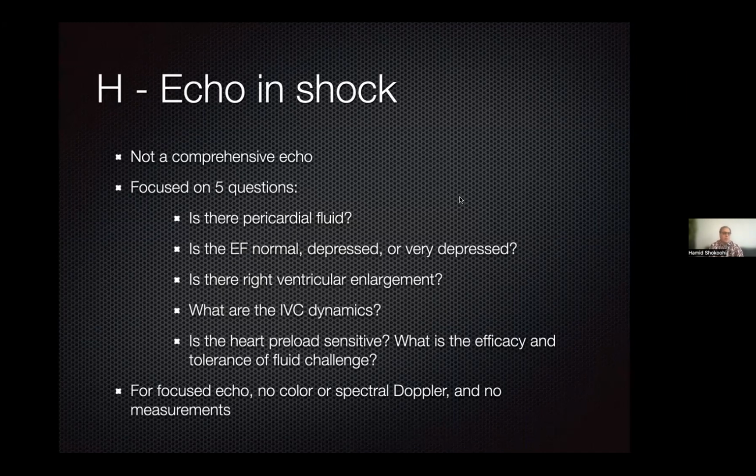In a lot of cases, especially older patients that you have seen, with a history of smoking and COPD, if you look at the scan, subxiphoid view is the best view they have. All you have is a good subxiphoid, and the rest is hard to even capture.